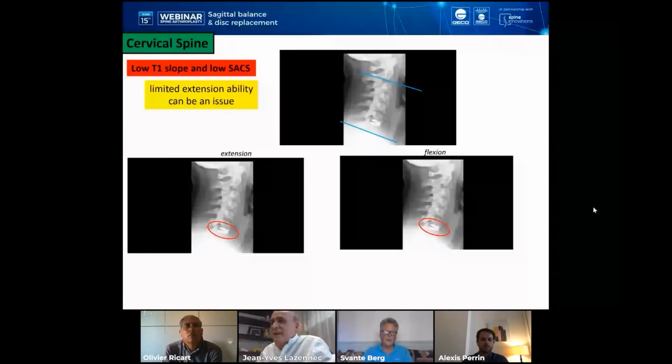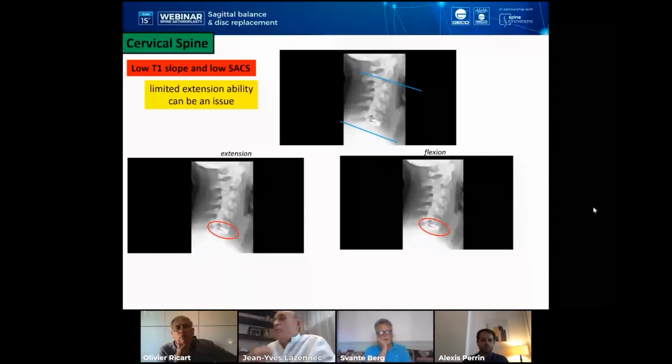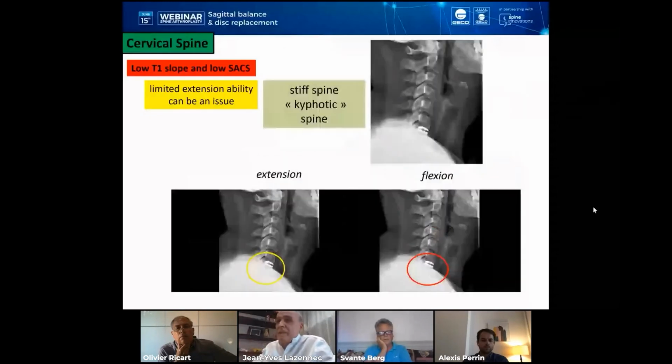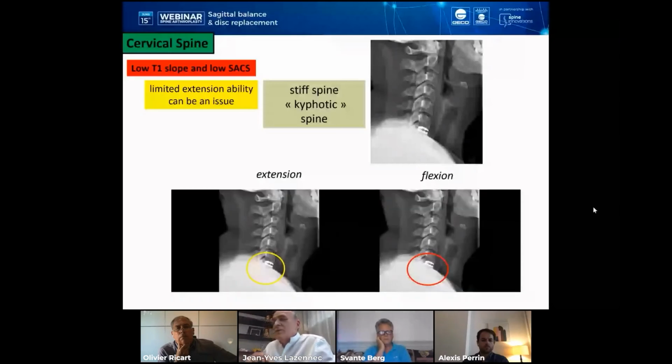Look at this patient, for example, you see this strange adaptation. We cannot believe that using a loose mechanical implant will provide a self-correct adaptation in all cases. Look at this case with a viscoelastic implant, the same problem. We are facing the same problem, less extension ability, but with the advantage of no fixed center of rotation. So the center of rotation can move outside of the prosthesis.